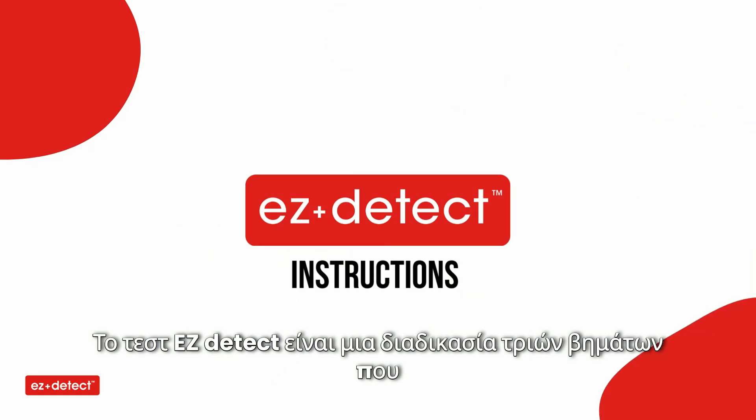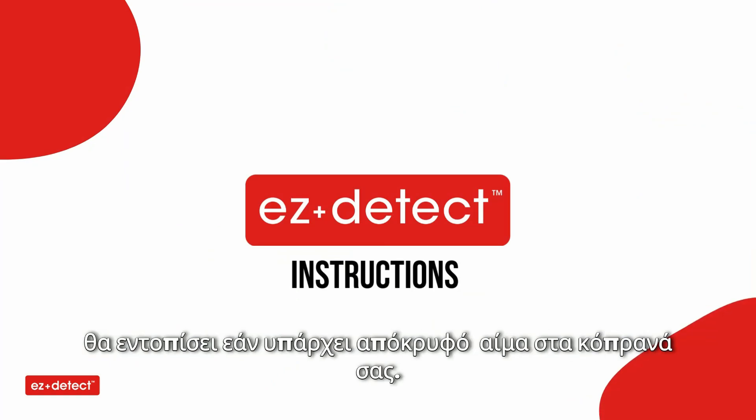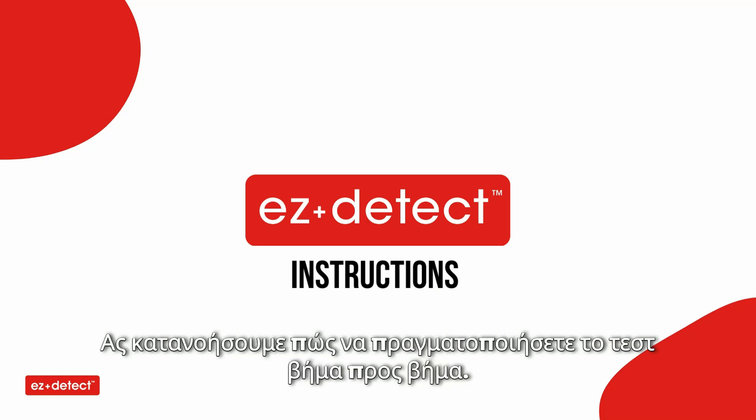The easy detect test is a three-step process that will identify if there is hidden blood in your stool. Let's understand how to use the test step by step.